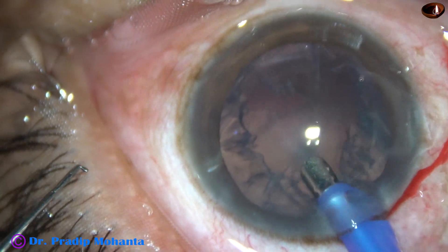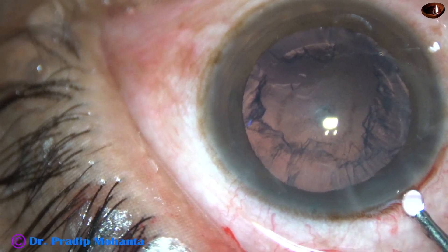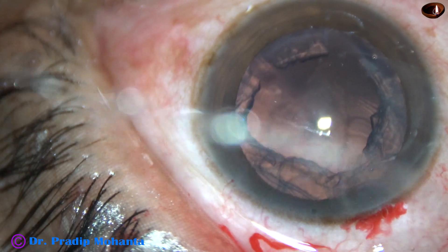This is the epinucleus — it has also come. So within a minute, the nucleus and epinucleus have been managed. If the nucleus is soft, as in this case, we can definitely proceed with FACO. There is no danger.